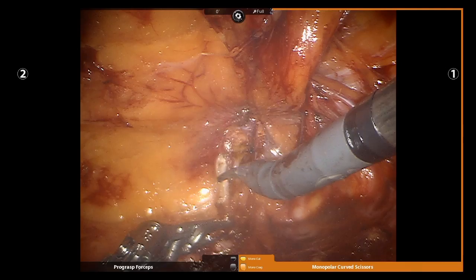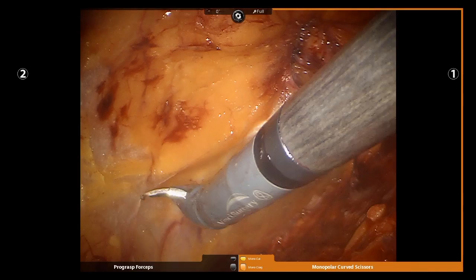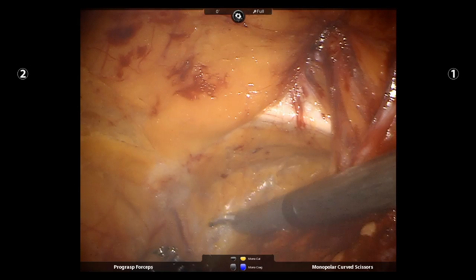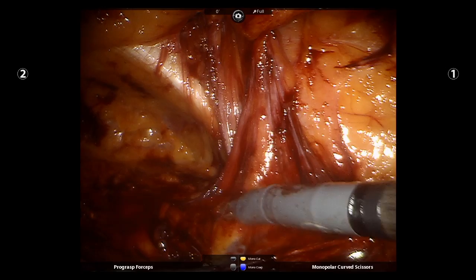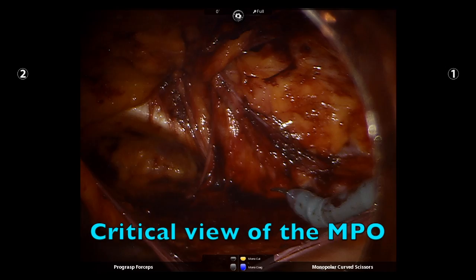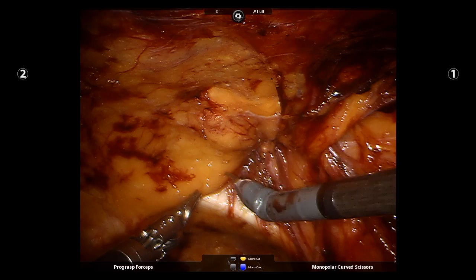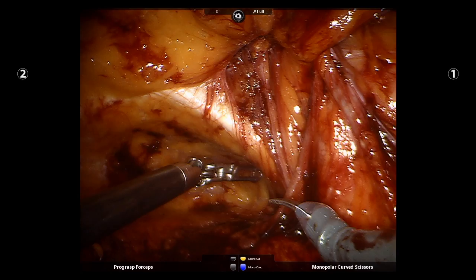Here you see medial dissection, exposure of the pubic symphysis, and dissection into the space of Retzius. Here is parietalization of the cord structures and posterior peritoneal dissection over the psoas. The critical view of the myopectineal orifice is identified, including the triangle of doom, the triangle of pain, the internal ring, the femoral space, and the obturator foramina.